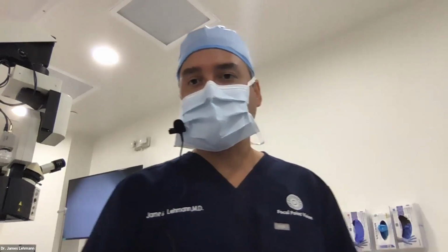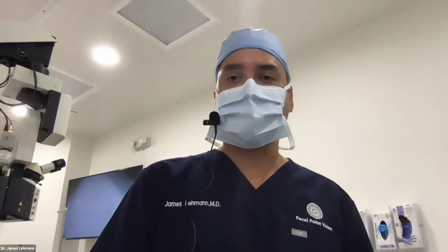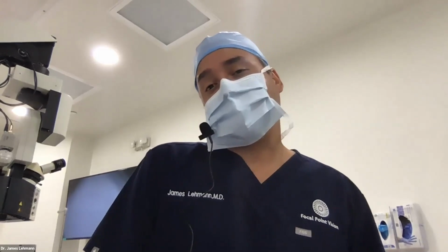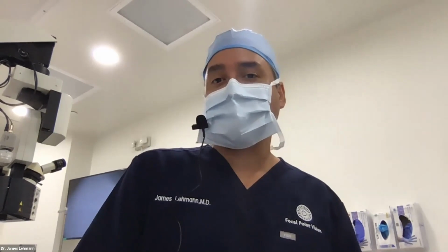Dr. Kashif asks, what about small pupils in diabetics? Yeah, those are no fun. You have to use a pupil ring for those. So there's different kinds. The Malyugin's the most famous. Diamatrix makes one, or iris hooks if you don't have any pupillary ring available.